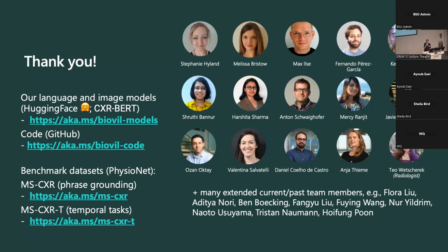For something that we have looked at, we do have access to a different data set that isn't MIMIC, and we're trying to generate reports. We thought about using the indication section, because this tells you something about the patient's history, or why the image is being taken. So we thought maybe that would help improve the quality of the report we're generating. And we found it had a really big impact when you change which center you're reporting from, because the indication was basically a proxy for which center it is.